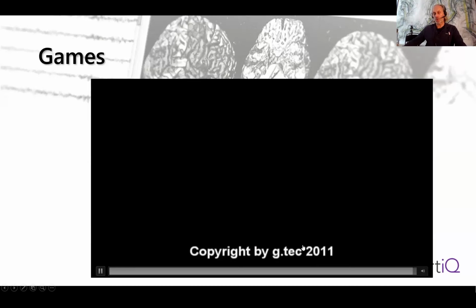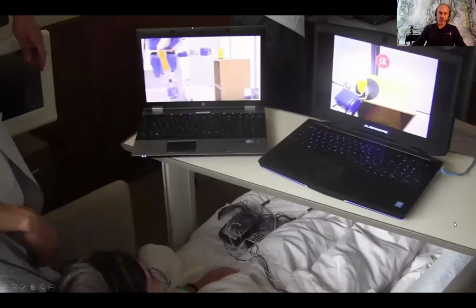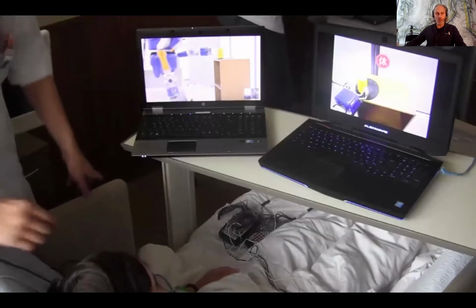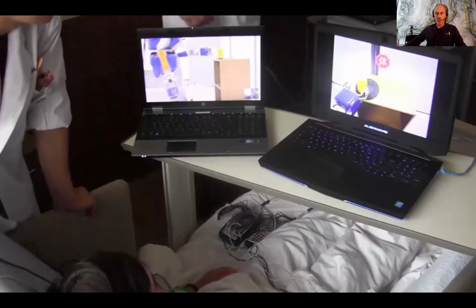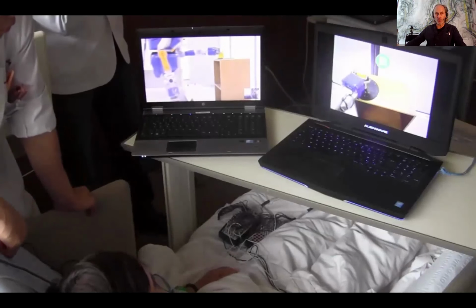So this was done in 2011, so 13 years ago. It was one of the first experiments ever done with ECoG and BCI. This is coming from the VERE project. So in this case, it was a telepresence experiment. We tried to control a robotic system from AIST in Tsukuba, which has a very nice robotics lab in Japan. And the epilepsy patient from Asahikawa Medical University was actually controlling the ECoG-based brain-computer interface.